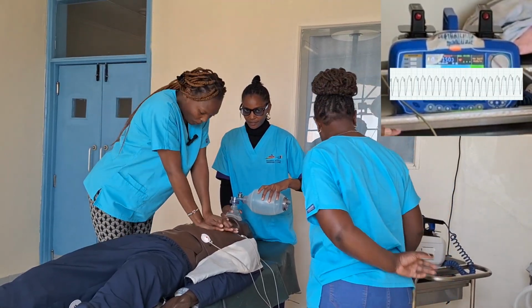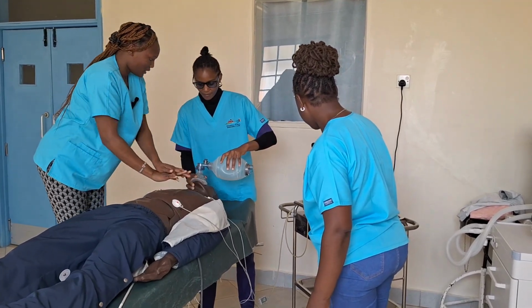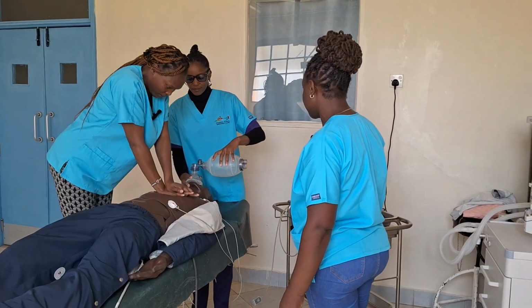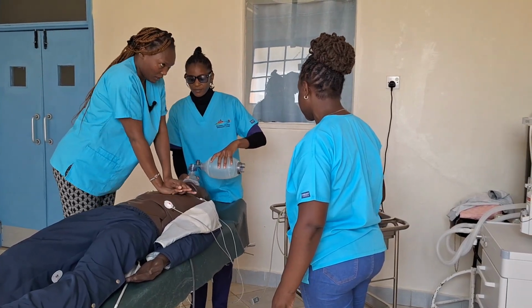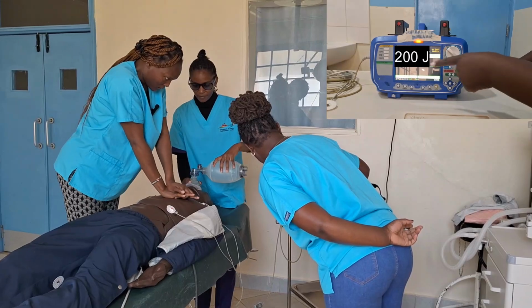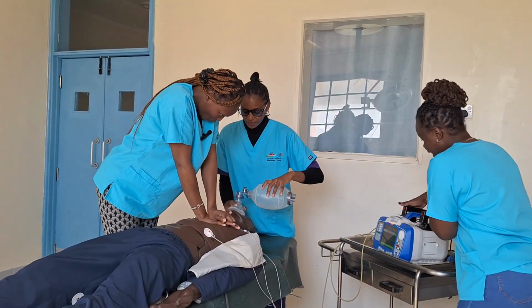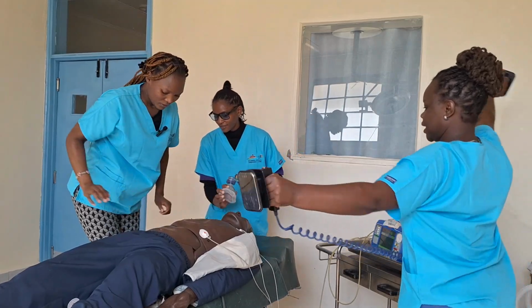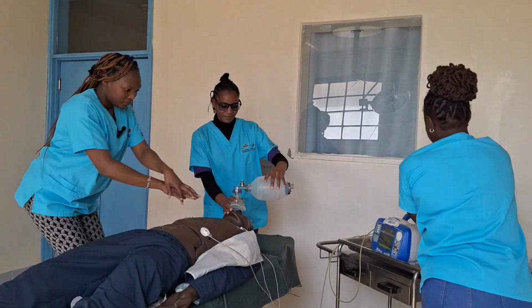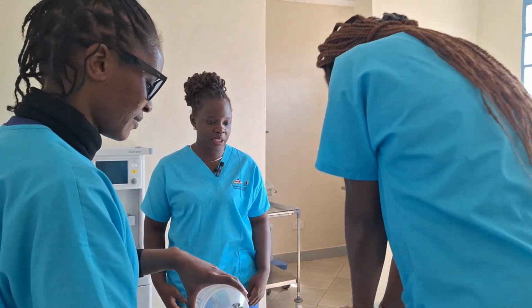Continue CPR. Emma, Jackie, when the monitor is fully charged, I'm going to tell you to step away from the patient with everything, including the oxygen. Is that clear? So charging to 200. It's charged. Please step away, oxygen, everything. Shock delivered. Continue CPR.